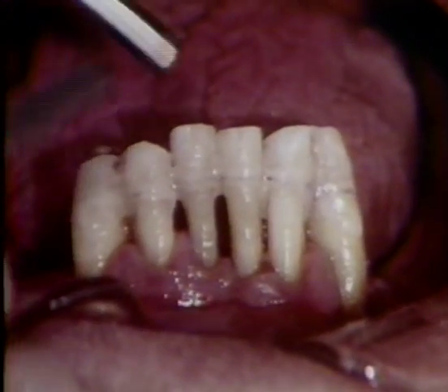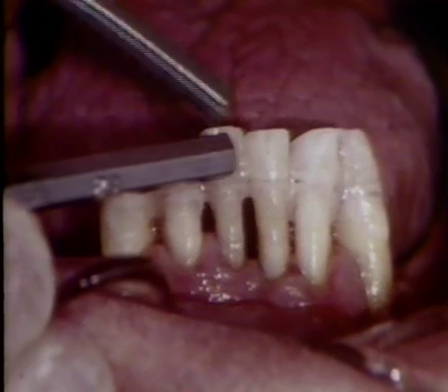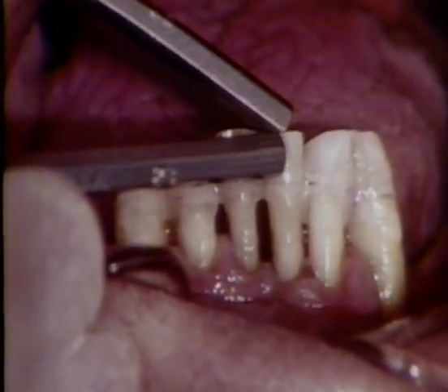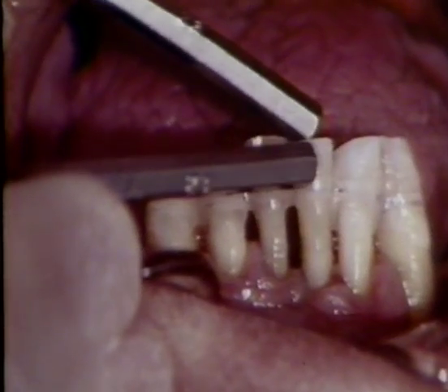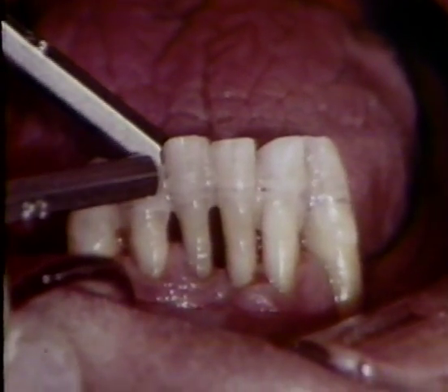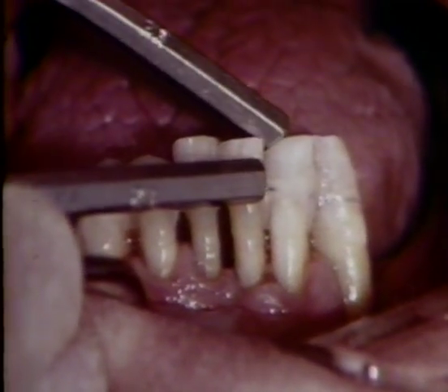When mobility is tested, it is obvious that the teeth are stable. The patient can eat comfortably and still practice good oral hygiene. This stabilization permits periodontal therapy to be initiated prior to the fabrication of a partial denture.